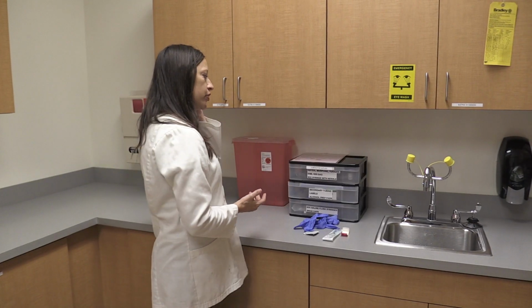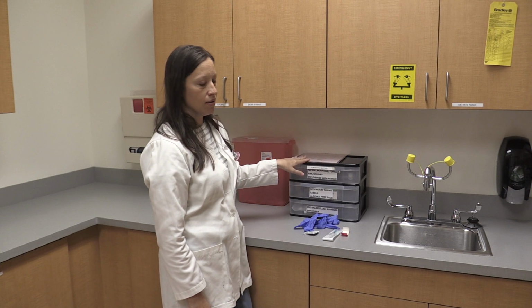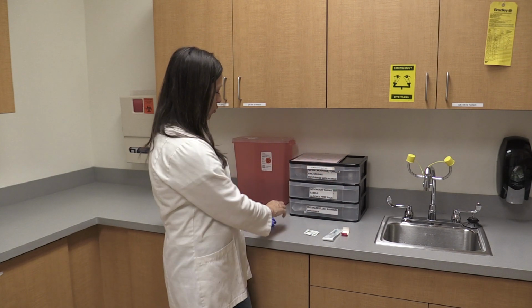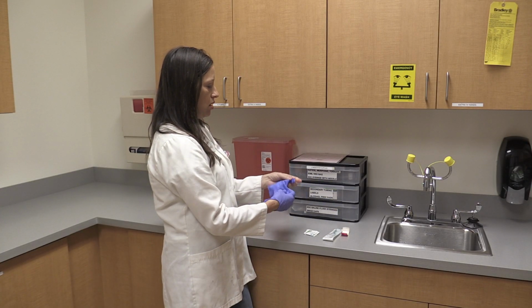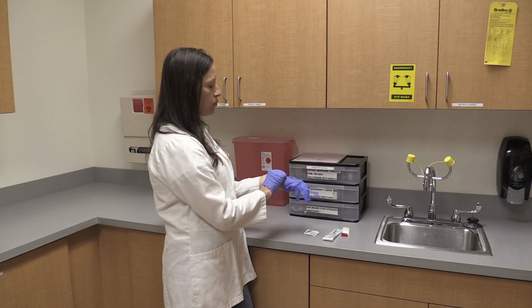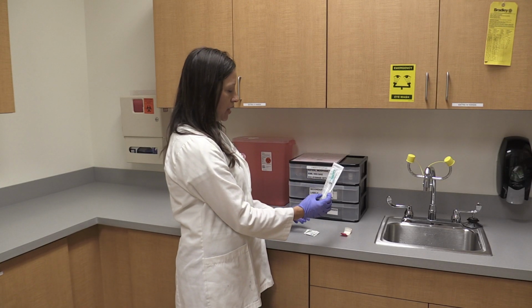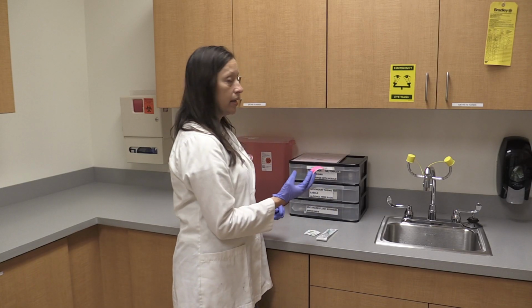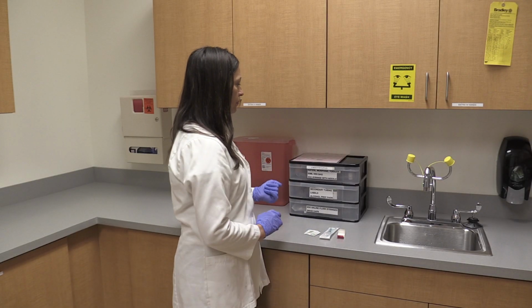So once I'm in the med room, all my supplies are in this box or Omnicell. I'm going to wash my hands and put my gloves on. And the supplies that I have with me are a 3 ml syringe with a needle to be able to draw out the medicine, my alcohol swabs, and then a label to put on the syringe for when I walk to the patient's room down the hallway.